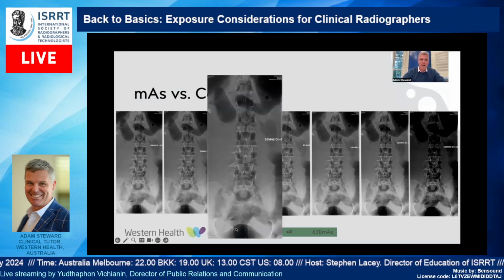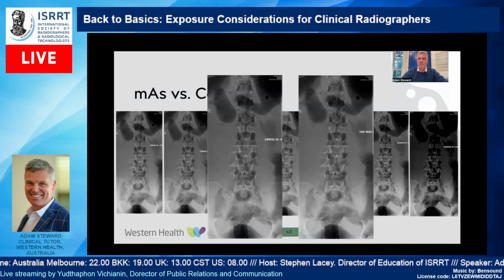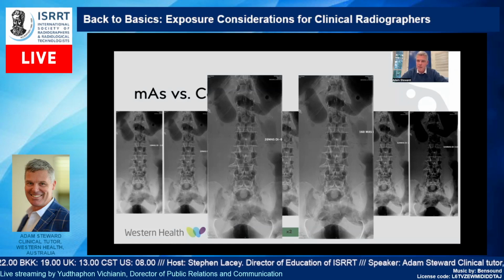If you look at 20 mAs and this 160 mAs, the difference visually is not great. The contrast is the same, and that's the reason: mAs really won't affect the contrast when you have an appropriate signal to noise. The latitude with digital imaging is incredible, nearly 30-odd times as we measured in our study. So it's really important to understand and look at the exposure you're setting in terms of that measurement, the DI or the EI or whatever your system uses.